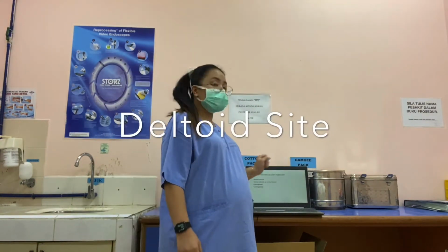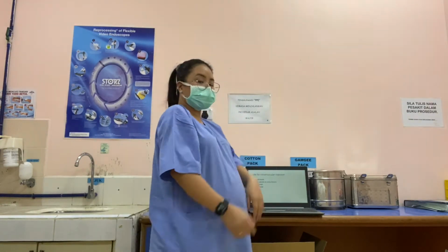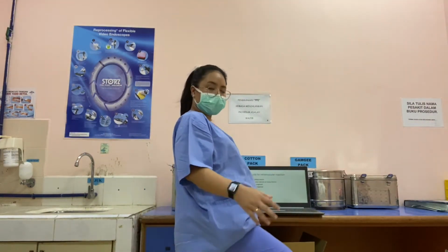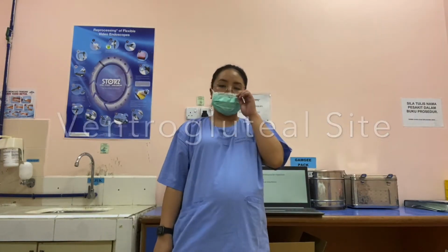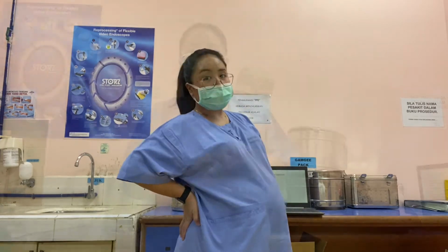For your information, there are certain sites of injection that you may give to the patient, which are the deltoid muscle over here, the vastus lateralis and rectus femoris, which are actually our thighs, and the dorsal gluteal and ventrogluteal, which are at our hip side, or we can call it the buttock side.